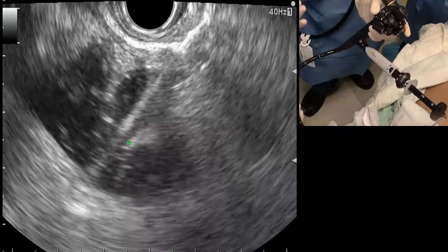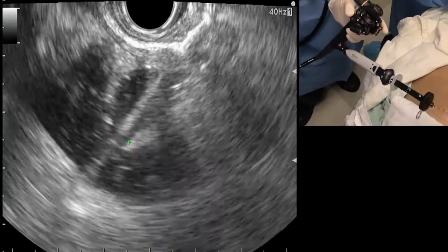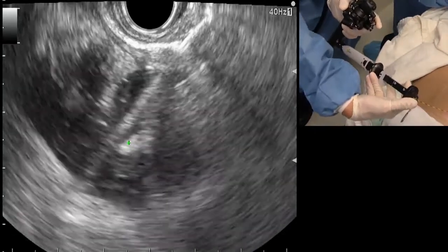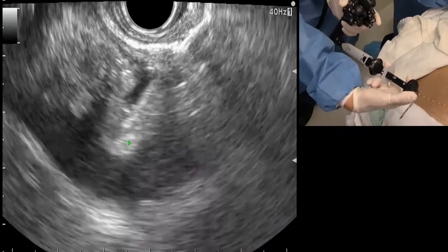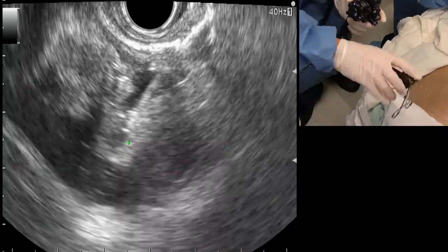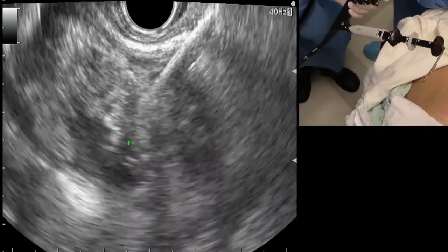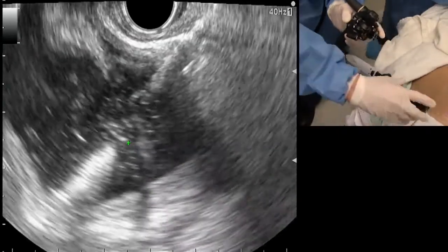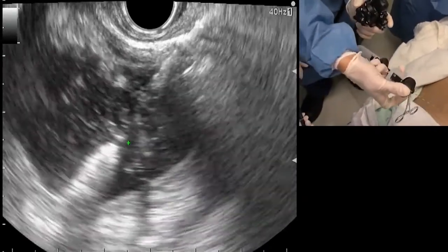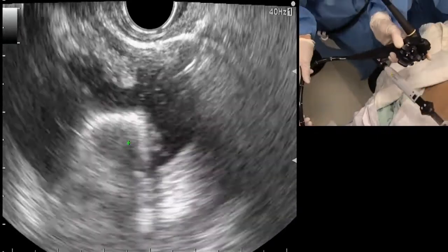And I'm going to release the flanges in two separate steps. First distal, then the proximal, completely independent of one another. I've unlocked, and I'm just going to pull back this gray hub. Very slowly, just pull it back. And I'm not going to pull against any excessive resistance. It should go fairly easy. And if you do have a lot of resistance, then back off. Have your nurse kind of hold the scope so you can keep your view. And I'm pulling back and waiting till it clicks. It just clicked, and you have to give it a second for the flange to deploy.